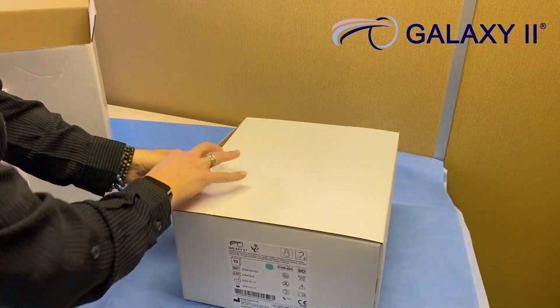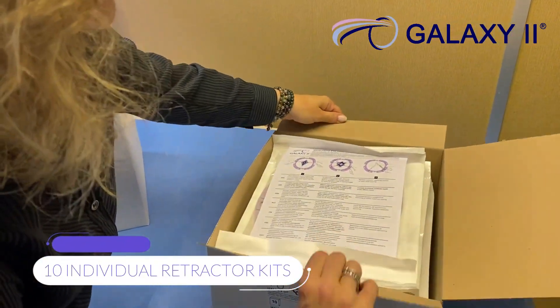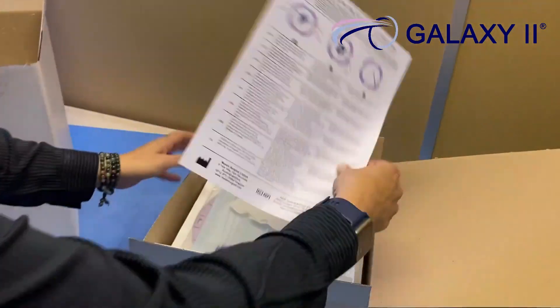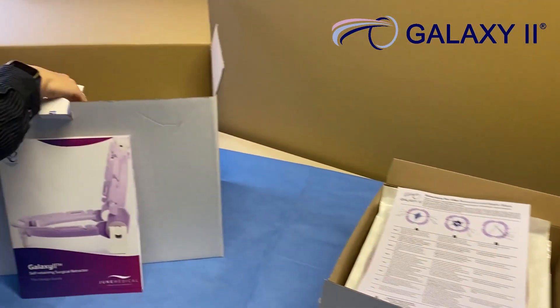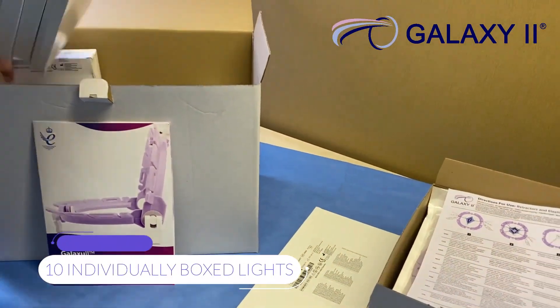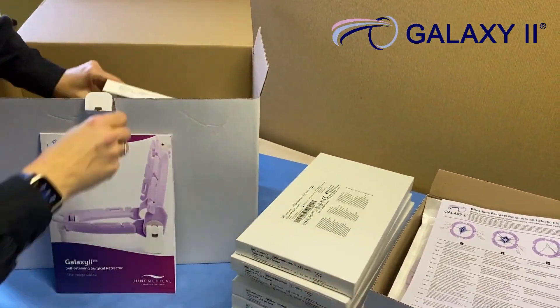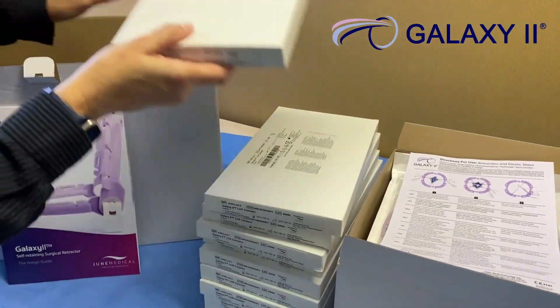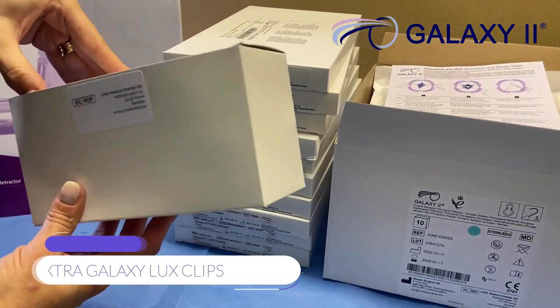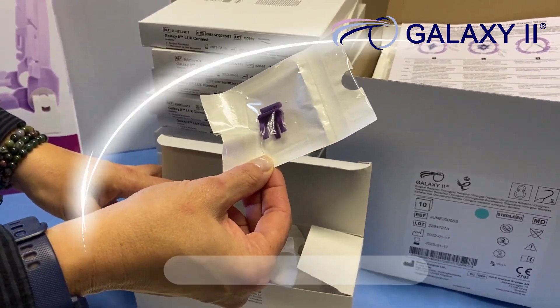When your Galaxy Luxe kit arrives, it will include 10 individual retractor kits, one kit for each procedure. It will also include 10 individually boxed lights, again one kit for each procedure. Also, one box of extra Galaxy Luxe clips to connect your light to the retractor.